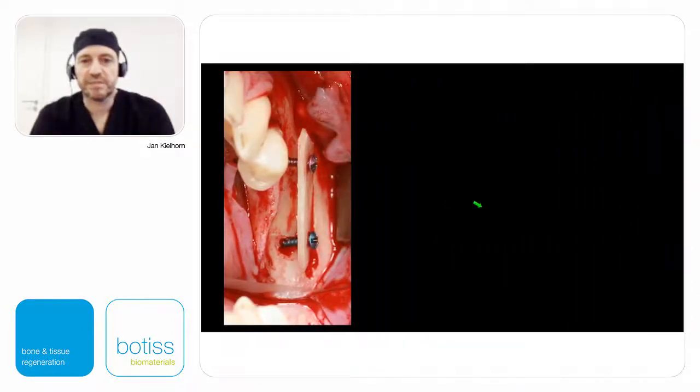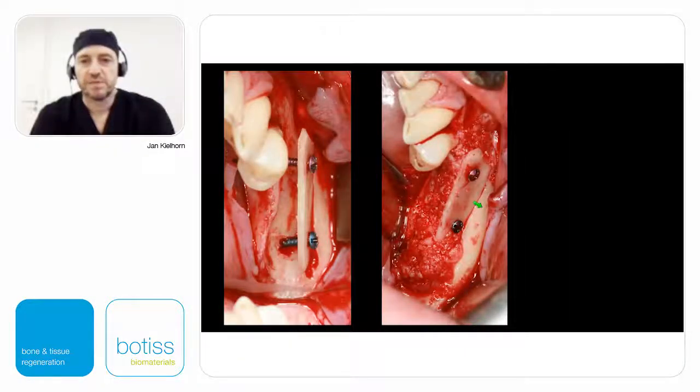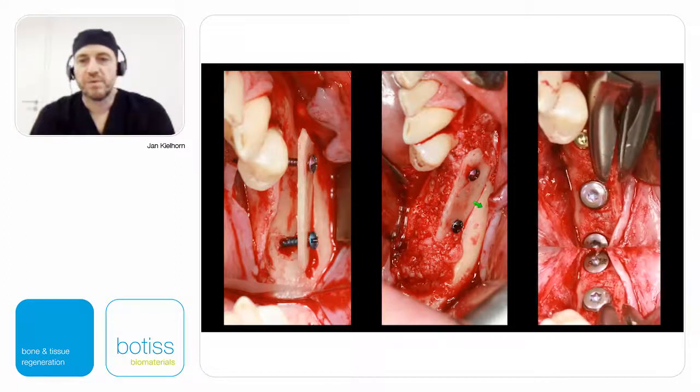Starting from there, which is a 7-8 millimeters gap, to there, we achieved a nice result where you can easily place a 4.1 strong BLT implant and still got enough space left and right. So that's a nice nature identical augmentation procedure.